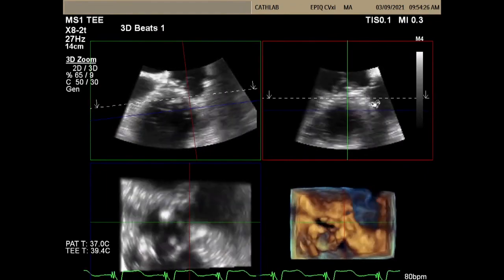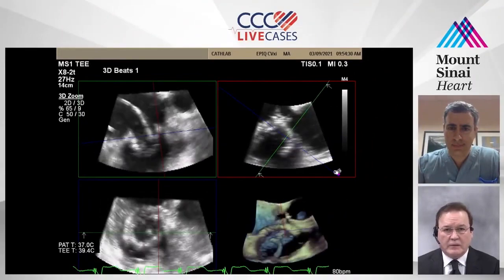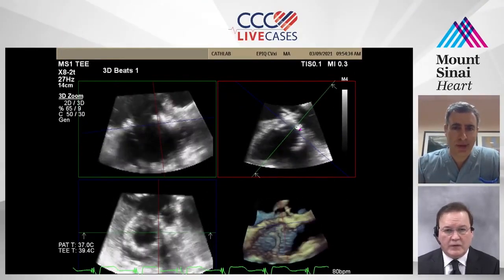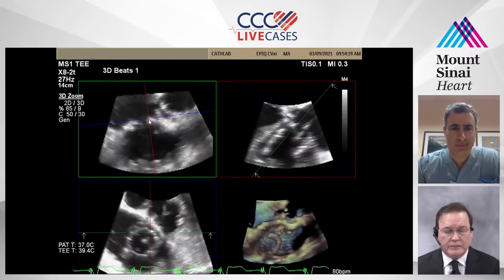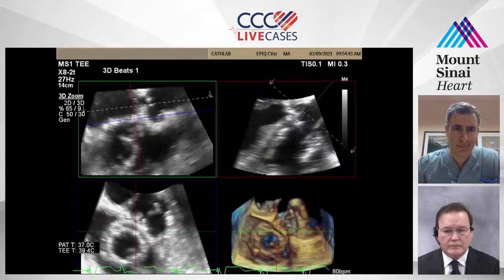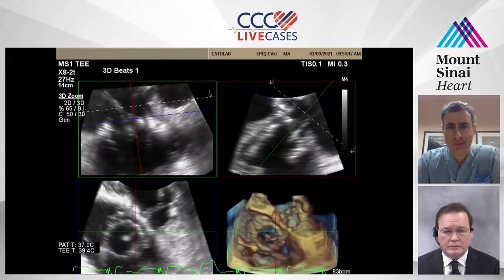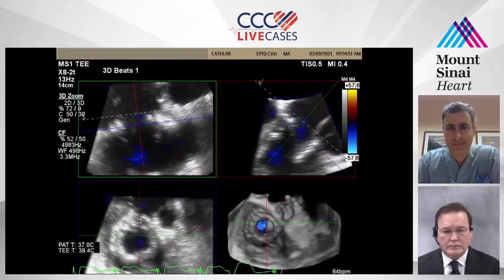So what are the reported complications of this procedure, if there are any? Valve embolization. Let's hear from... ventricle or outside? Both of them. Could be either, if you're not holding it at the right... No, but as pointed out also, is the valve thrombosis, right? And of course, endocarditis, paravalvular leak, and all those things, but those are the worrisome ones.